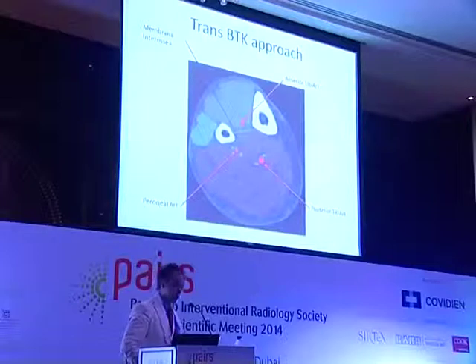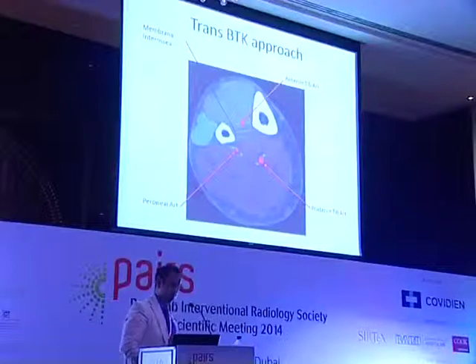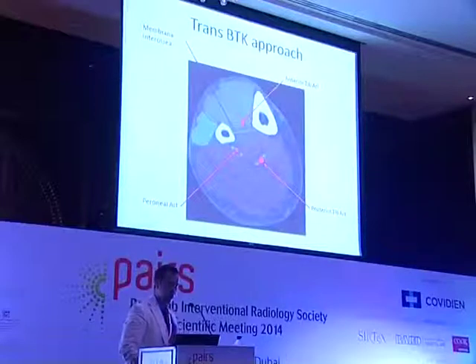We can puncture the 3 arteries, but as was mentioned earlier, we prefer the posterior or anterior tibial artery and the peroneal artery, in fact, in case of no more options and limb salvage, extreme limb salvage, because of less compression and risk of hemorrhage.